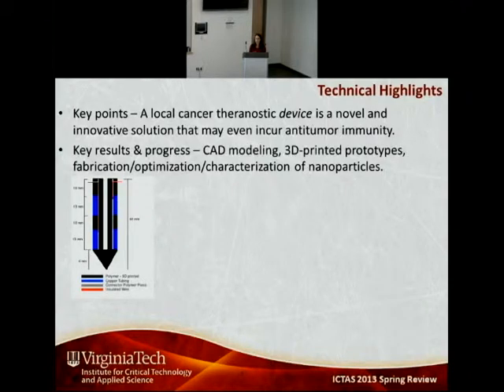And then we have these different components that you can slide over the needle base, over the shaft, and these components can be conductive, such as this blue one, and then non-conductive. What's unique about the design is the inside: you can feed electrodes down these cutouts in the components and prevent crosstalk between the two electrodes, which is pretty important when you're trying to do any kind of electrical iontophoresis or electroporation of your system.